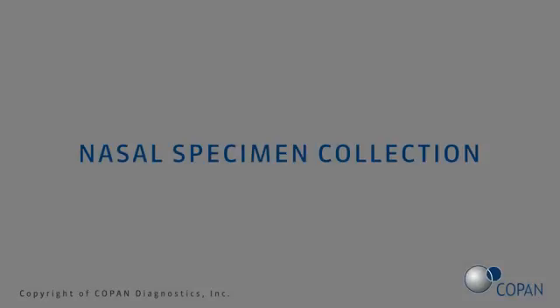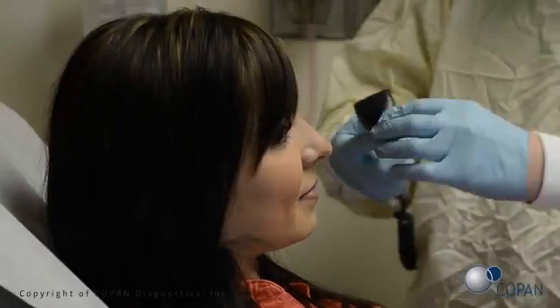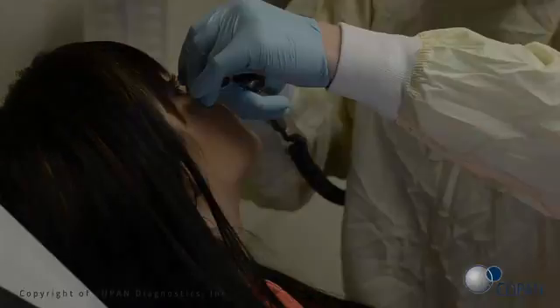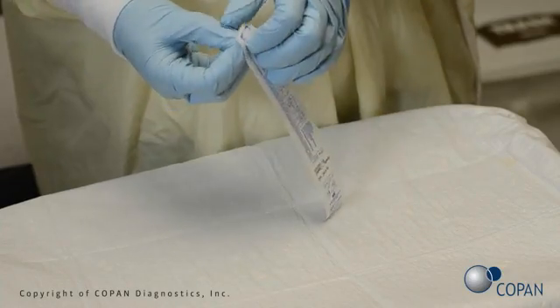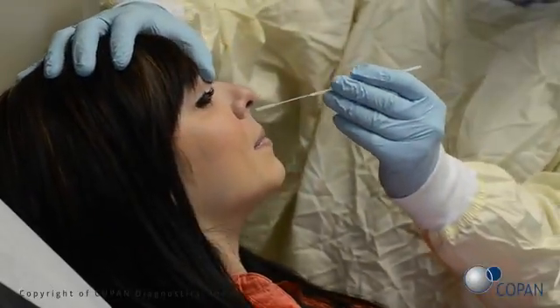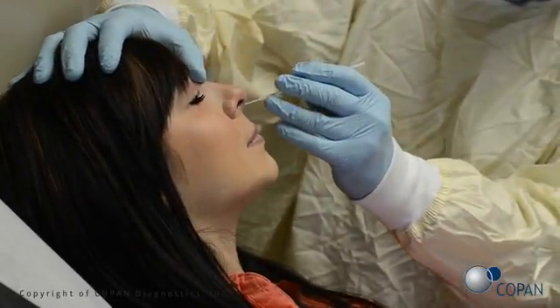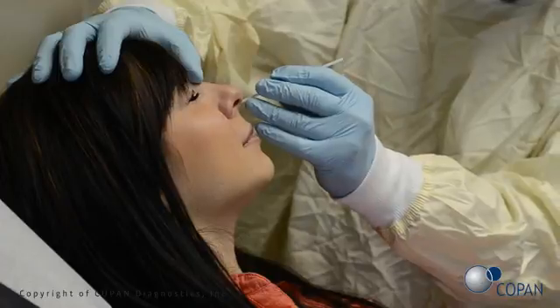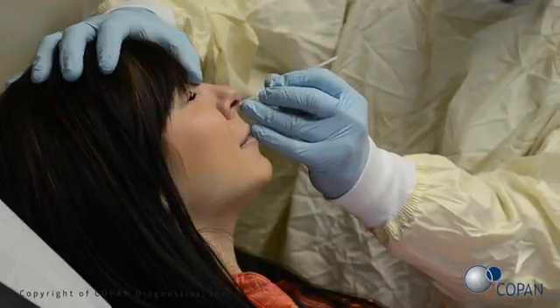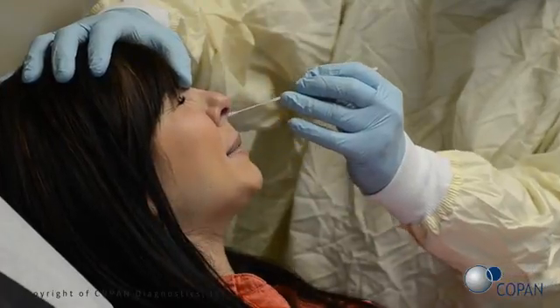To first collect the nasal specimen, check for nasal obstructions. Open the swab package. Gently insert the swab into the nostril. Using a gentle rotation, push the swab until a slight resistance is met at the level of the turbinates. Rotate the swab several times against the nasal wall.